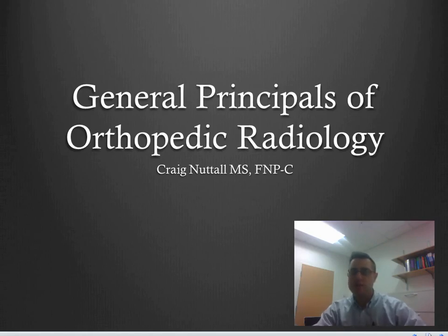This is the general principles of orthopedic radiology according to Craig Nuttall. And again, I am not a radiologist, but I have done family medicine and I've seen a lot of x-rays. And so I'm going to try to teach you some general principles.